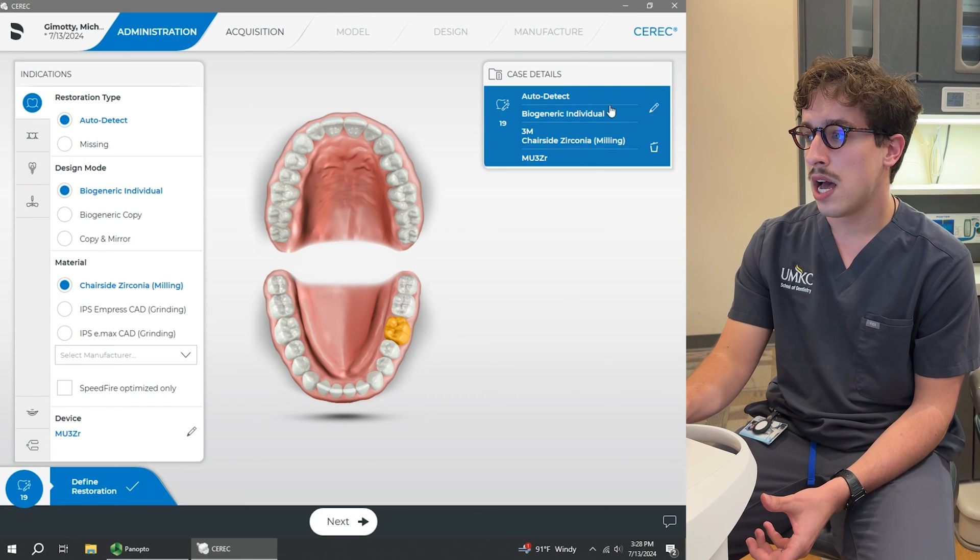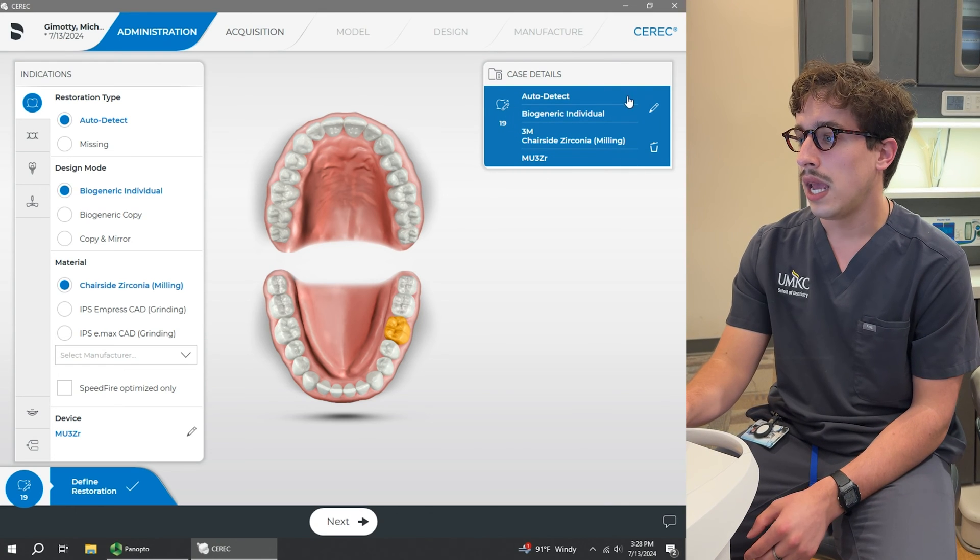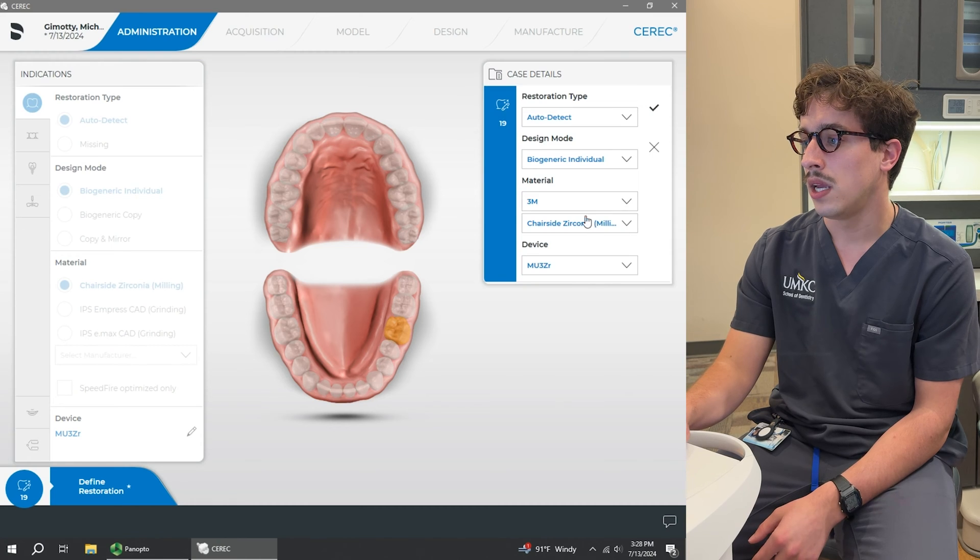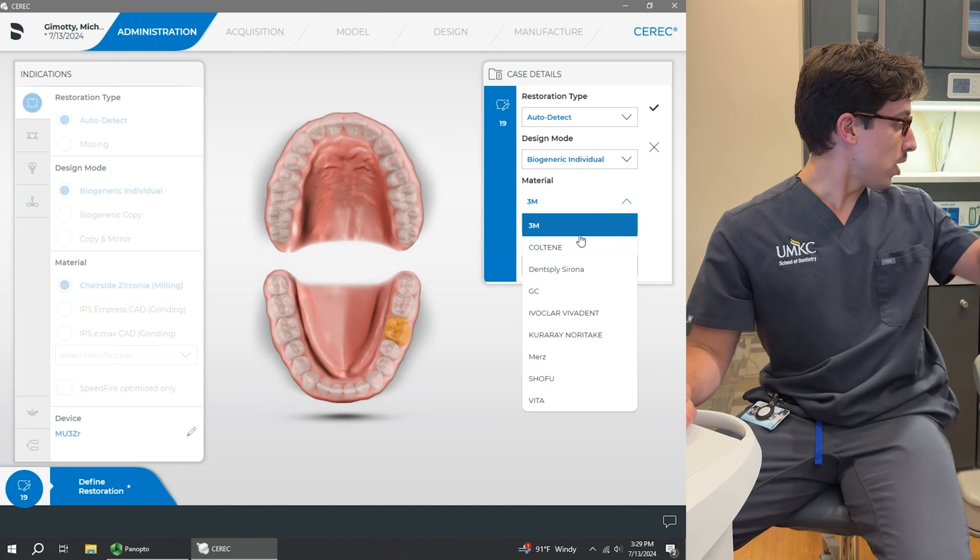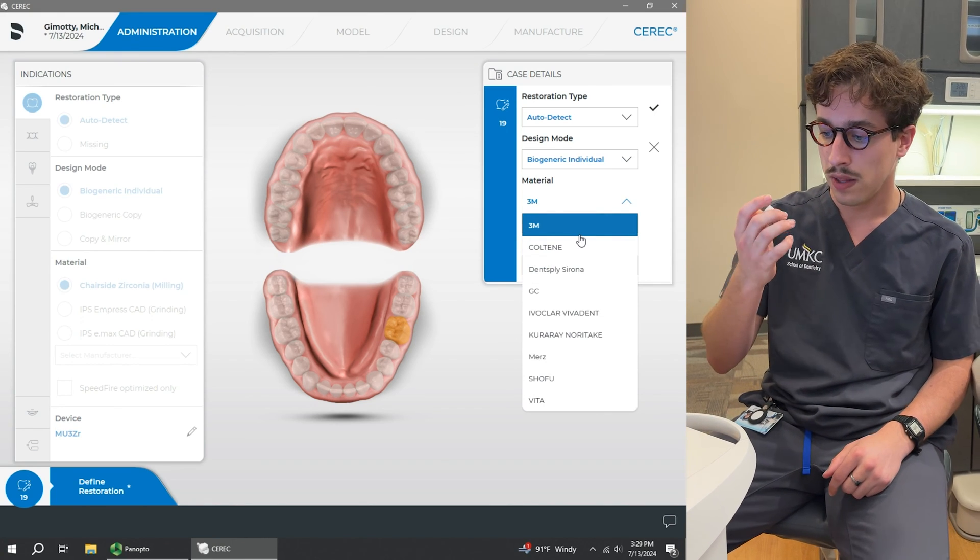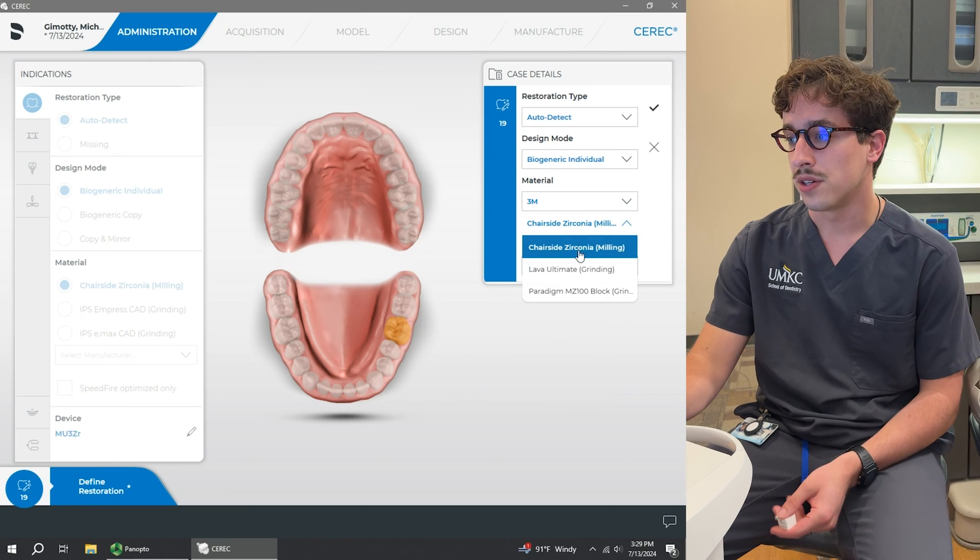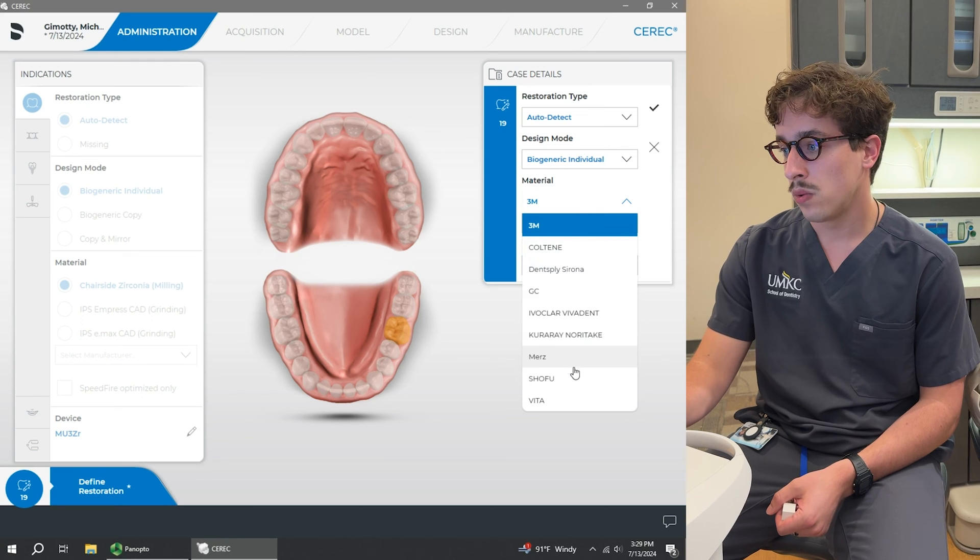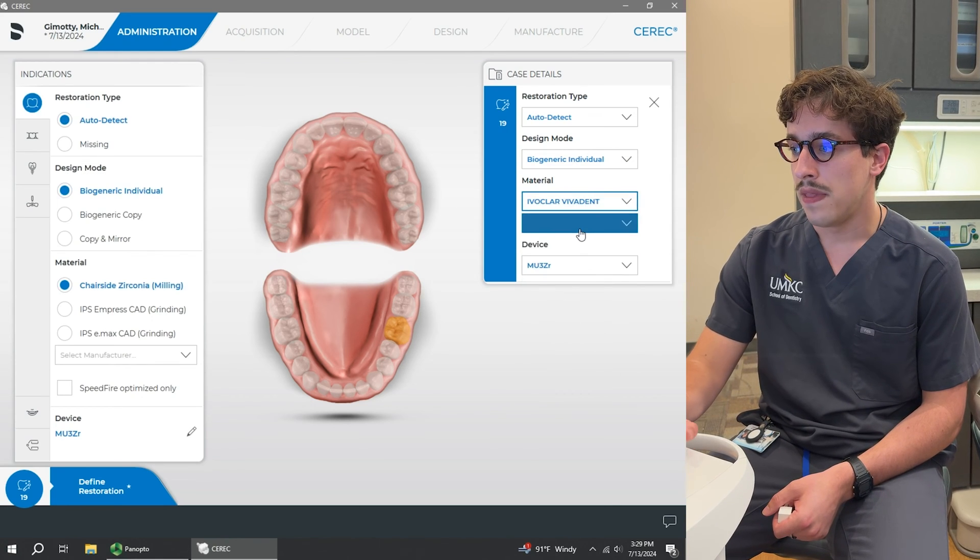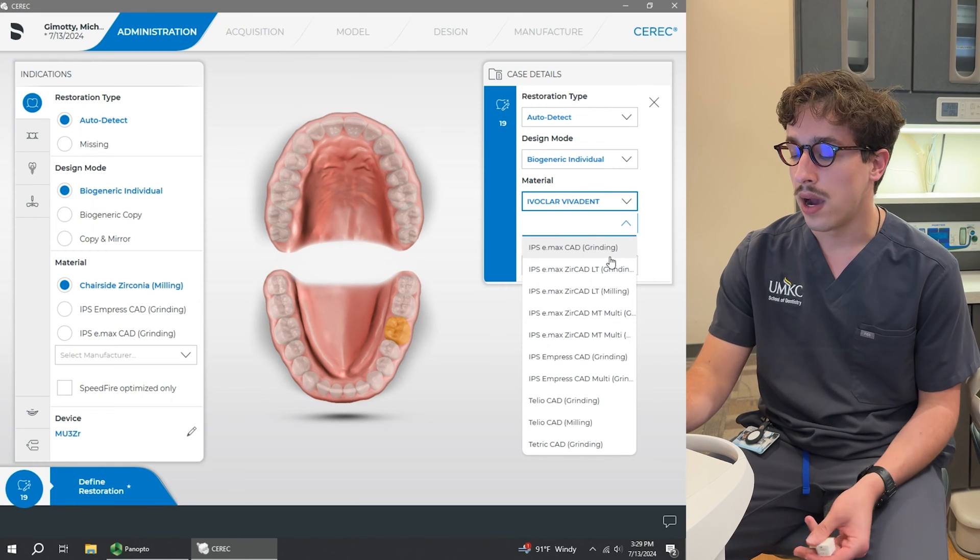So up here in the top left, you can see that it's selected tooth number 19. And we're going to click on the little Edit tool right here. So we're going to choose the correct material, in which case we already have here, but it's going to be under 3M, which you can just see on the block right here, that this is from 3M. So select 3M and then chairside zirconia milling. If we were going to be doing Emax, what we would do is we would click on Ivoclar Vivadent and then choose Emax CAD grinding.